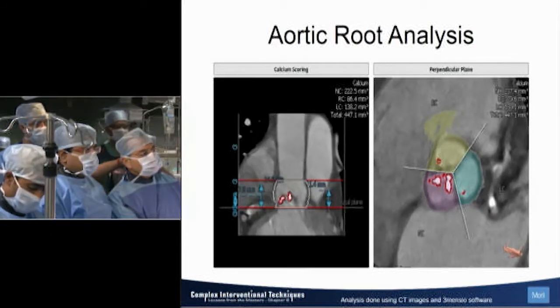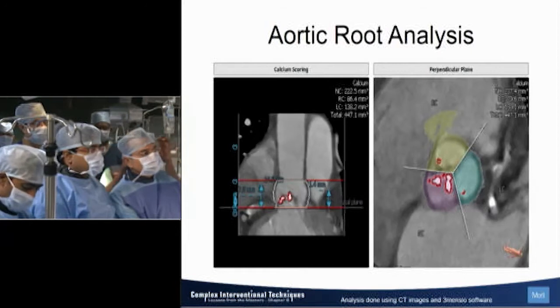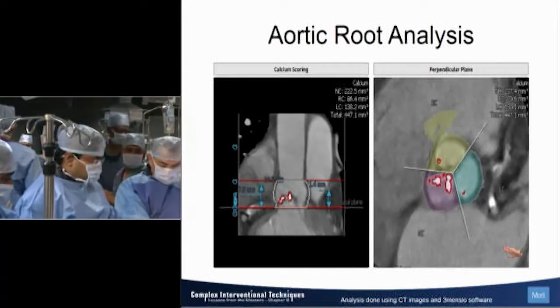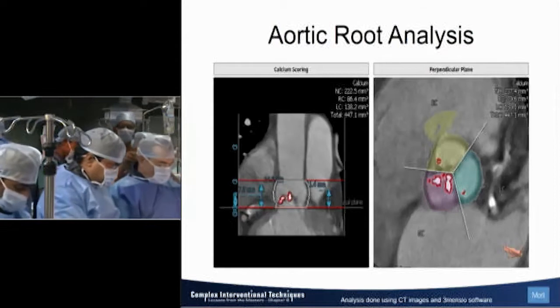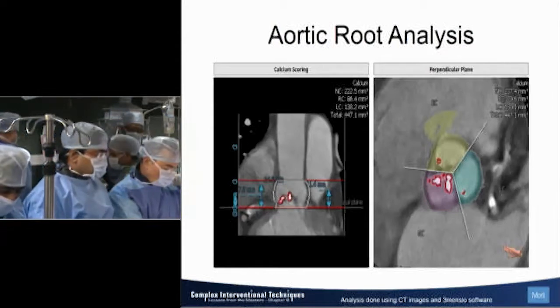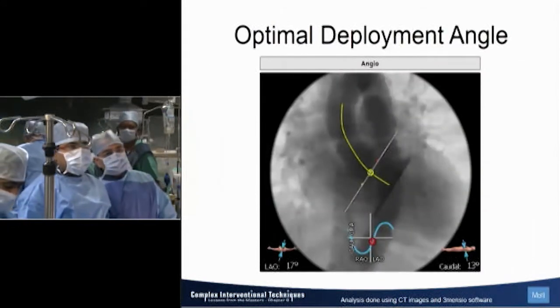So now maybe we can go live. What we have done is we have taken a 6 French axis on the right common femoral artery, and we've put 3 ProGlides on the left side, upsized the left axis to an 18 French sheath. We've crossed the valve using an AR catheter, and we'll be showing you the hemodynamics here. Okay, so we can go live now.